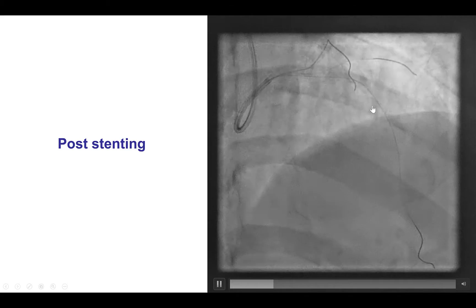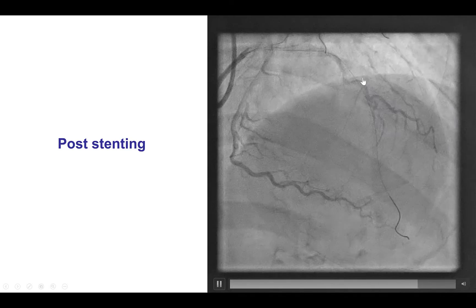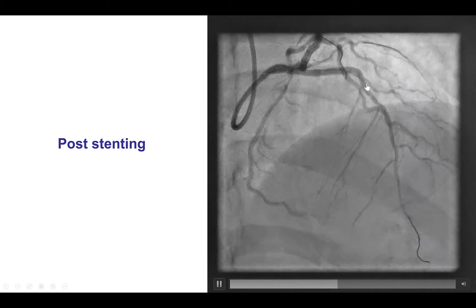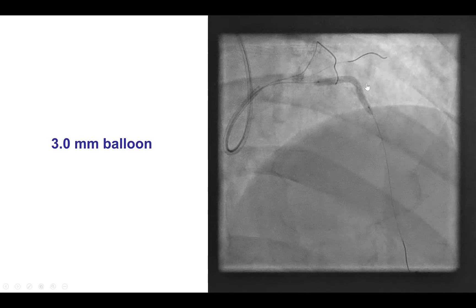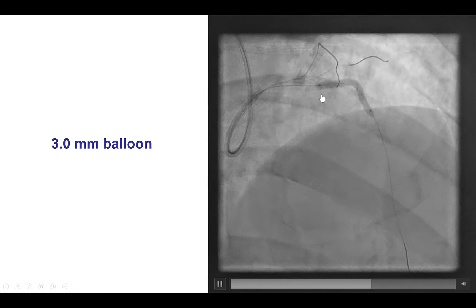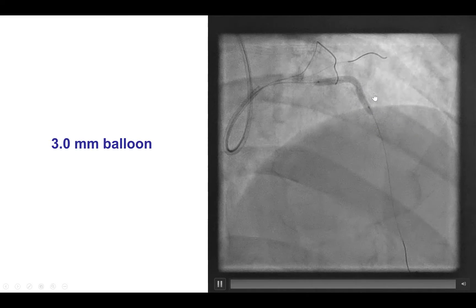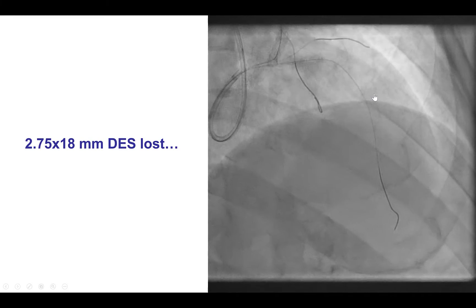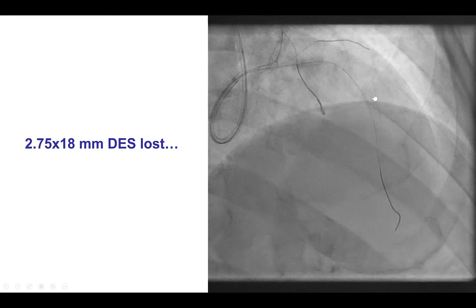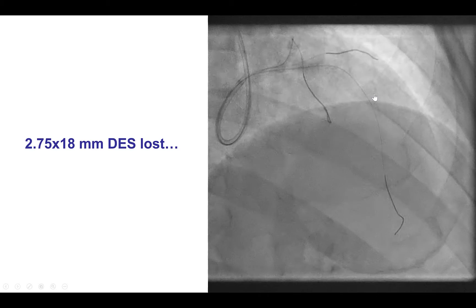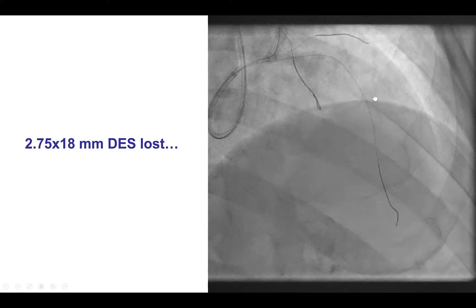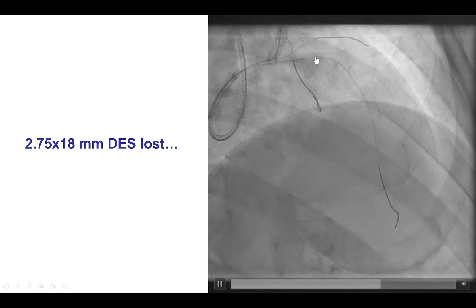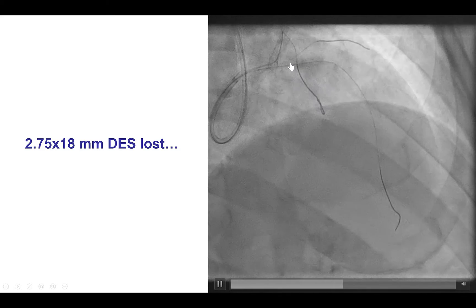Stenting of the LAD provided a nice result in the proximal segment. However, there remained an area requiring additional treatment distal to the distal edge of the initially placed stent. We used a 3.0 millimeter balloon to pre-dilate further, but then had difficulty delivering a 2.75 by 18 millimeter drug-eluting stent, which unfortunately came off the balloon and remained in the proximal LAD.